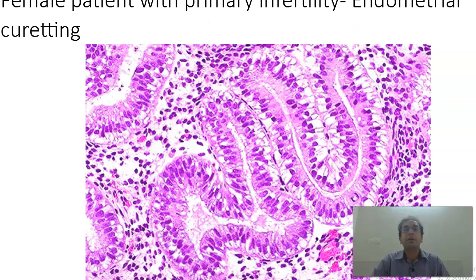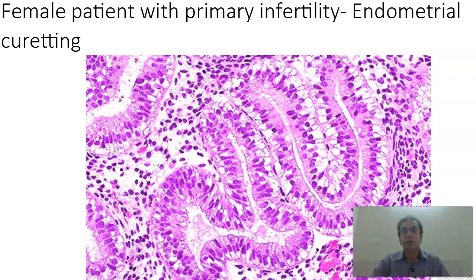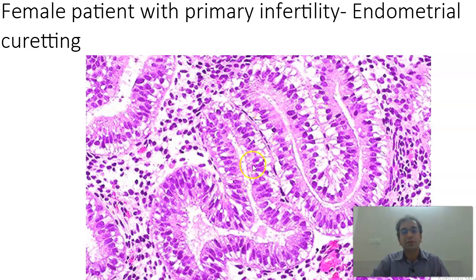Coming to a female patient with history of primary infertility and endometrial curettings. The history of primary infertility is mentioned but you do not find anything abnormal. Usually with that history you would look for granulomas, but here we do not find that. What you find here is subnuclear vacuolations, nice tortuous glands, and edematous stroma. This is a secretory endometrium.